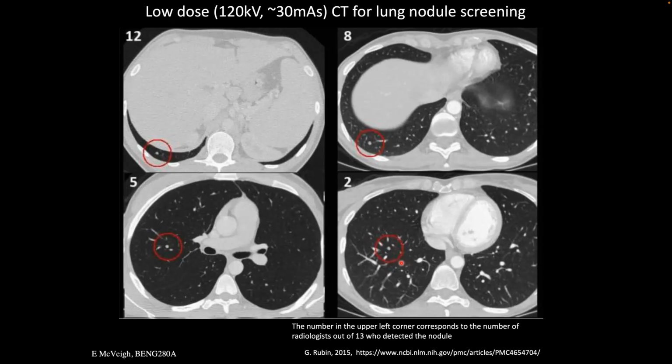So this is a great application, obviously, for machines, right? You really want to train a machine on 10 million of these pictures, and that exists, right? You have hospitals full of CTs, and you know outcomes of patients from their records that they did have a lung cancer or whatever.